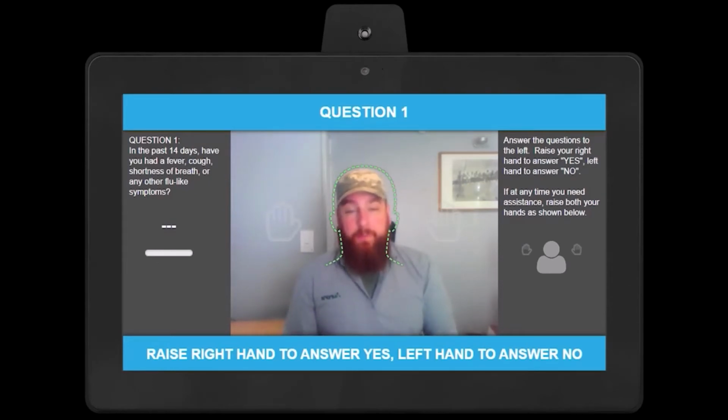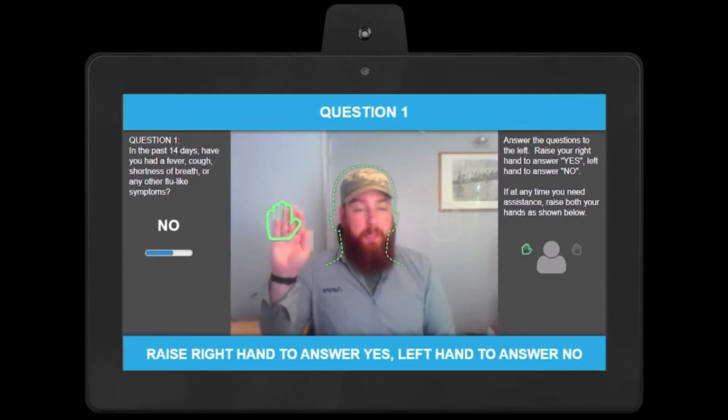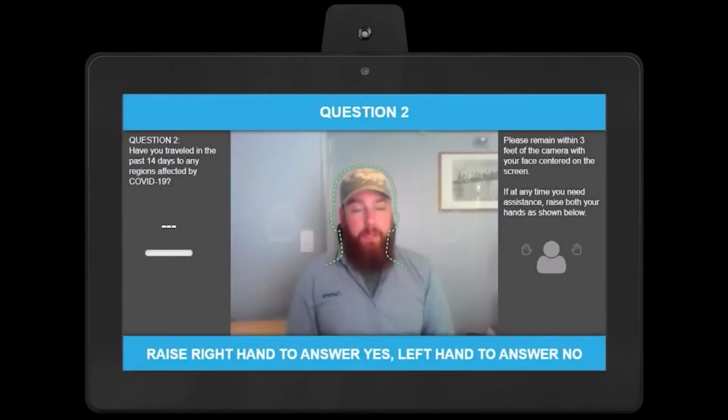So question 1, in the past 14 days, have you had a fever? I have not, so I'm going to answer no to this question. You'll see there's a little bit of feedback there. You have to hold your hand there for just a moment. And that allows you, if you're answering the wrong thing, putting up the wrong hand by accident, to change that before it registers.